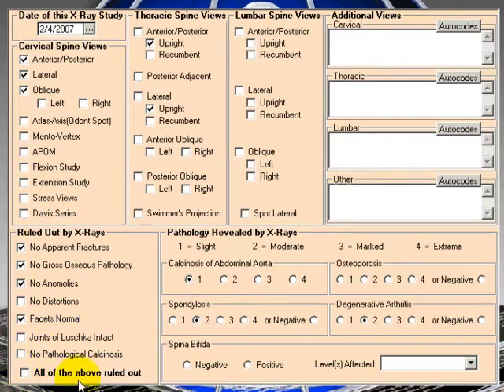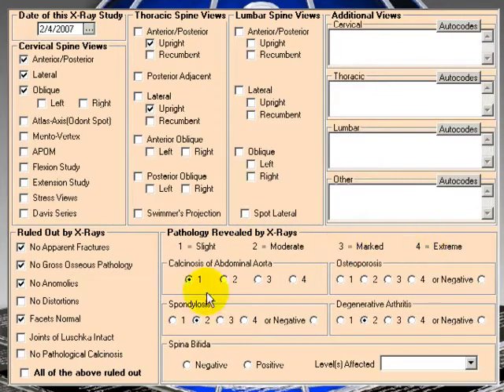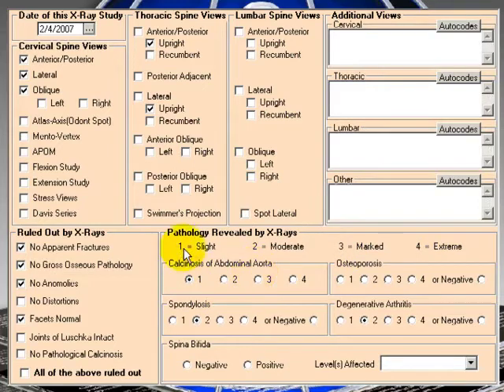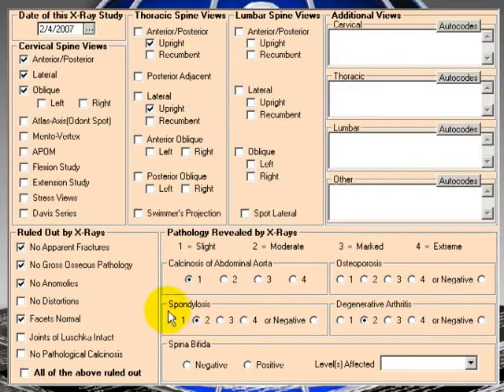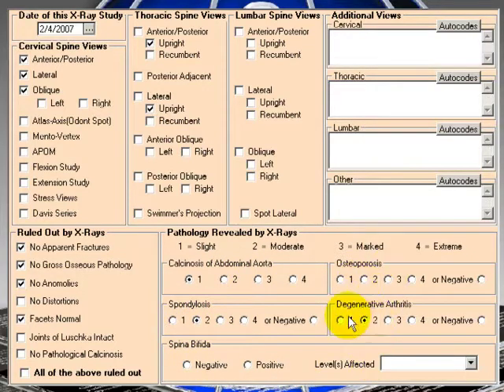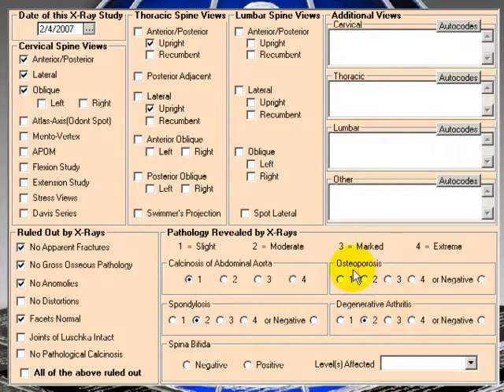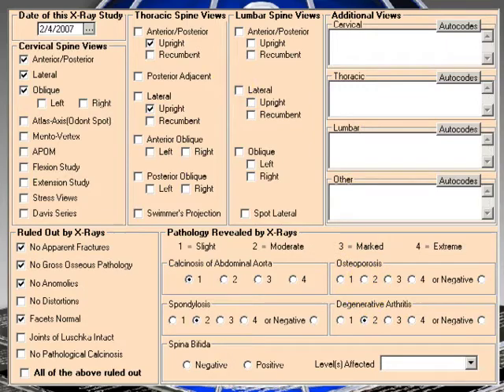Here we have what pathology revealed by x-rays. This is slight, moderate, marked, or extreme. Here we have calcinosis, so slight calcinosis of the abdominal aorta. Here we have moderate spondylosis, and let's see, here we also have number two, moderate degenerative arthritis. We don't have anything checked off for osteoporosis.